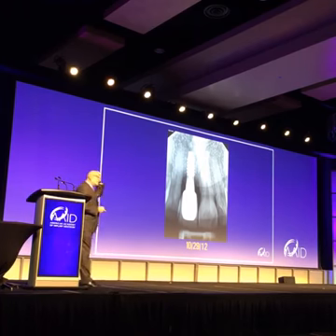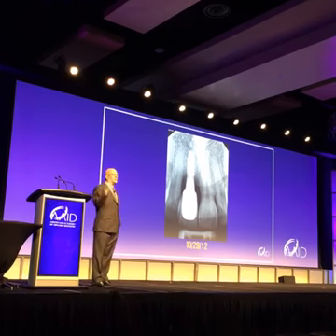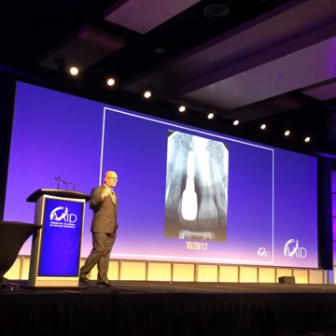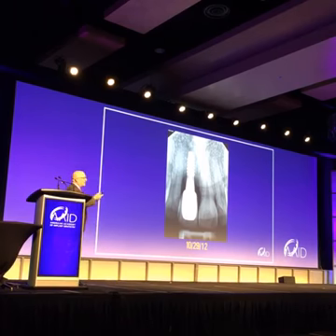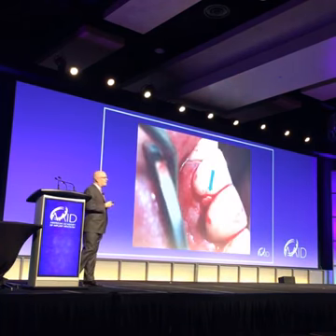So here's a case. A young man in his 30s came in and saw me. He was going to go see another periodontist, who was going to flap it open and do an exploratory. I didn't want to have exploratory surgery done on me on this one, so we went ahead and treated him with the LAPIP protocol. Here's why he needed surgery: we had a lot of inflammation, nodular pockets, etc.